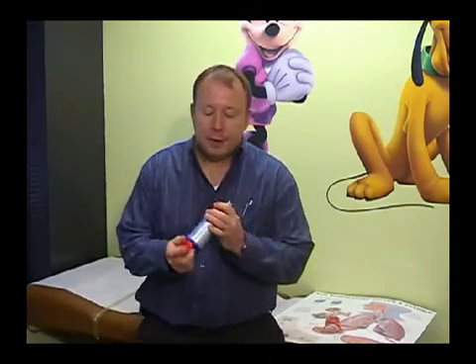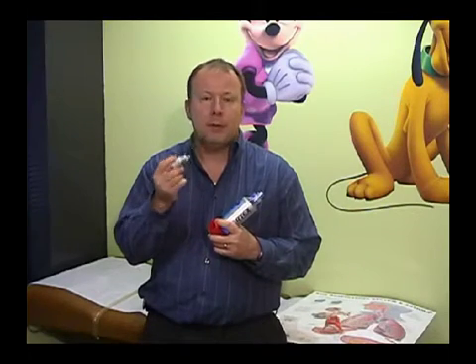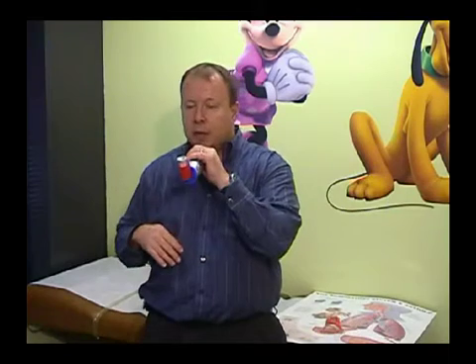In an adult who's able to fully cooperate, the technique is pretty simple. You shake it up good. The medicine inside that canister settles out in about 10 seconds, so you'll want to shake it every single puff. So shake it up, you blow out all your old air, put it in your mouth, puff it, take one slow deep breath in and hold it for 10 seconds. When you take that breath in, it gets the medicine down to where it's supposed to work, and then you hold your breath so that the little particles will fall out into the airways where they need to work.